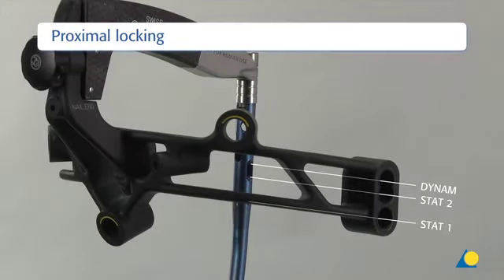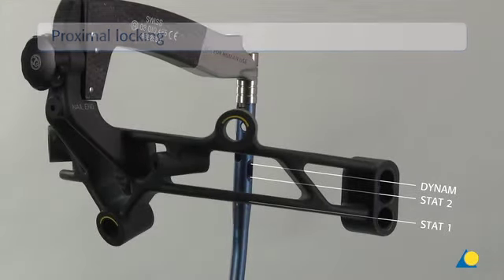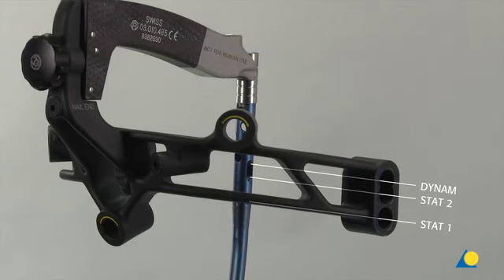3 proximal mediolateral locking options can be targeted using the aiming arm. 2 are described in this section. Static locking option 1, marked Stat 1, corresponds to the most distal of the proximal locking holes. Static locking option 2, marked Stat 2, corresponds to the lower position of the proximal locking slot. This type of locking does not allow primary compression or secondary controlled dynamization.